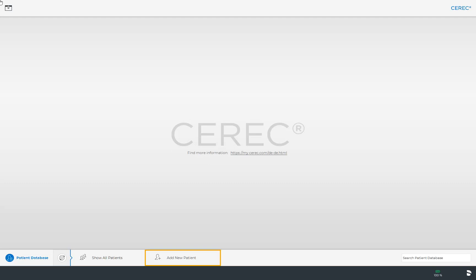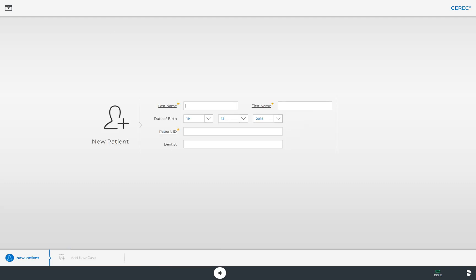First of all, we set up a new patient. We enter the last name, first name, if needed the date of birth, a patient ID, and the name of the treating dentist.